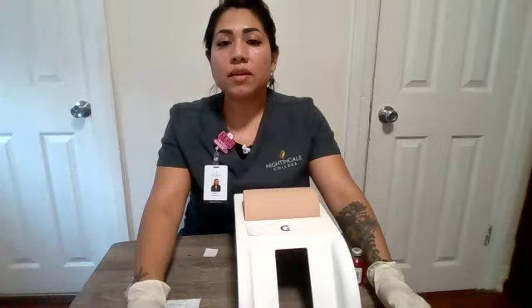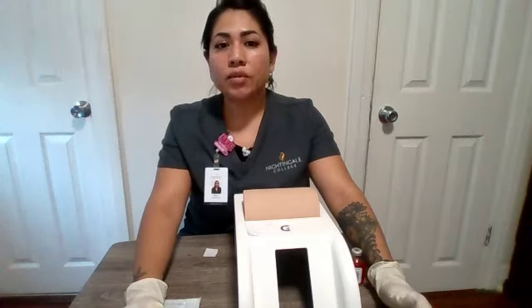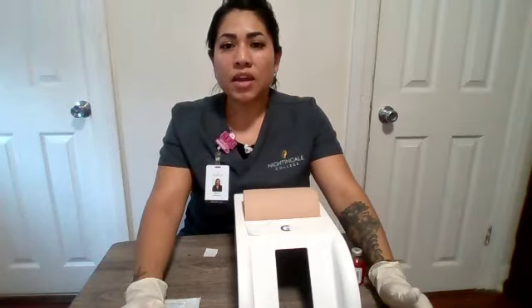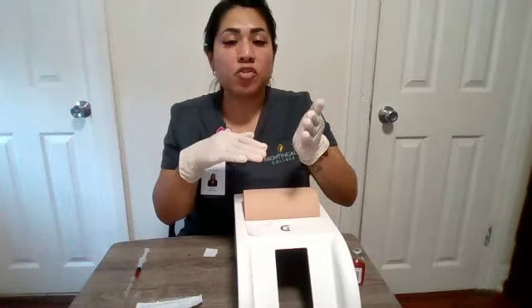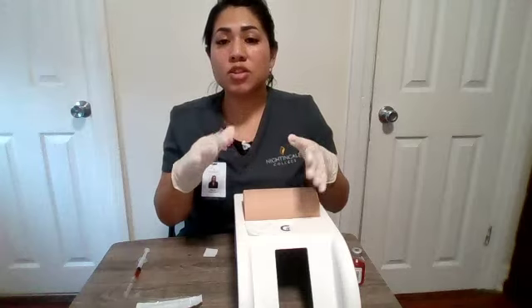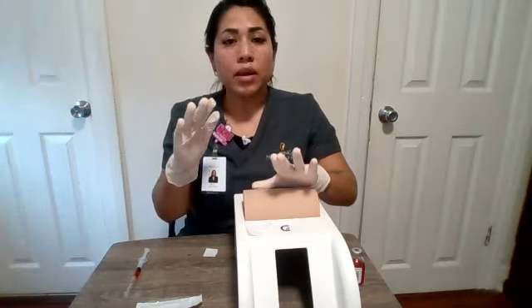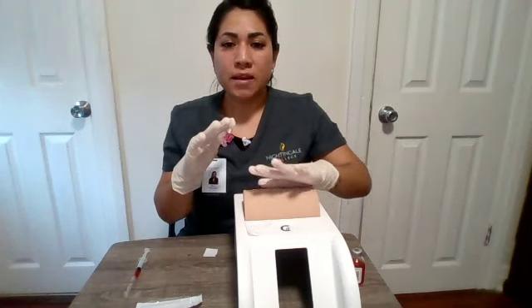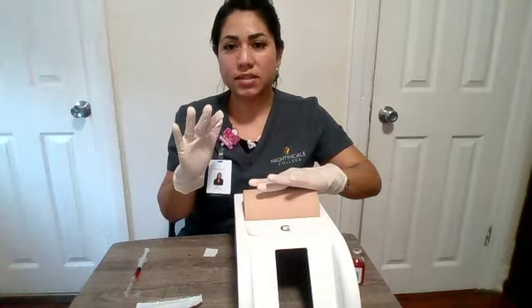Now I'm going to start off by locating my patient's injection site. So it will be the ventrogluteal site, and I would have the patient lying down in a supine or lateral position. Then I will put the heel of my hand on the greater trochanter, and I will make sure that my wrist is almost perpendicular to the femur, and I will point my thumb towards the patient's groin, and I will extend my fingers up along the patient's iliac crest.